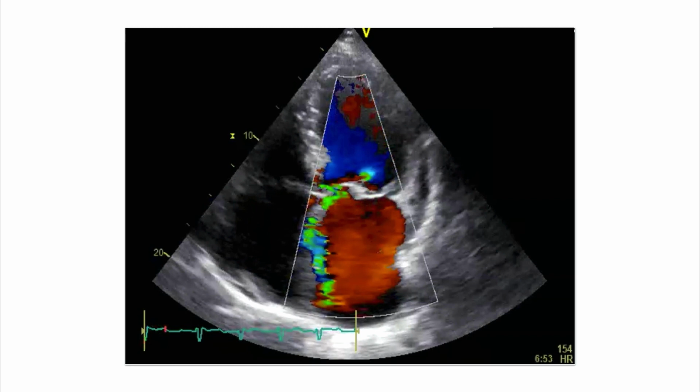As mentioned previously, some jets are very, very eccentric. You see that it impinges here on the intraatrial septum, and in essence doesn't look very broad. However, and this is the key point, this part of the jet is rather large. This is the flow convergence zone.